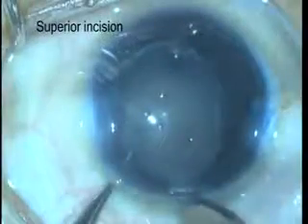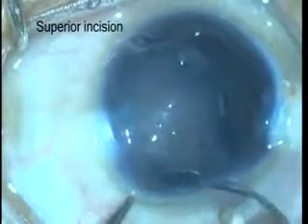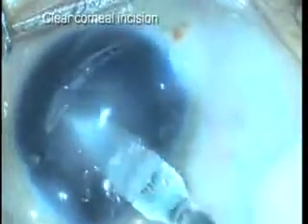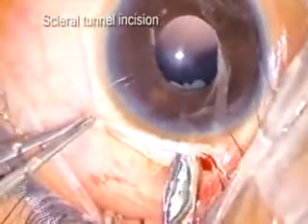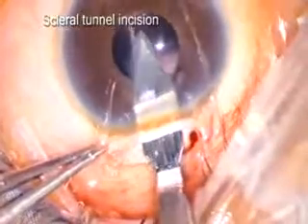The superior incision is safer as it is protected by the eyelid. A clear corneal incision is preferred for implanting a foldable intraocular lens. A scleral tunnel incision is made to facilitate the implantation of a non-foldable lens.